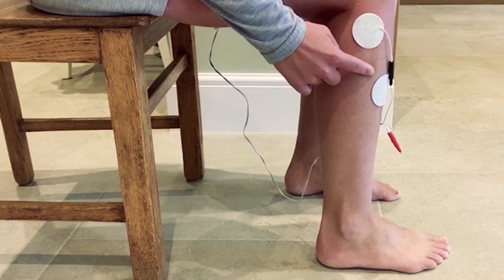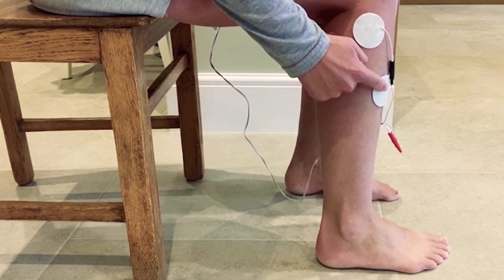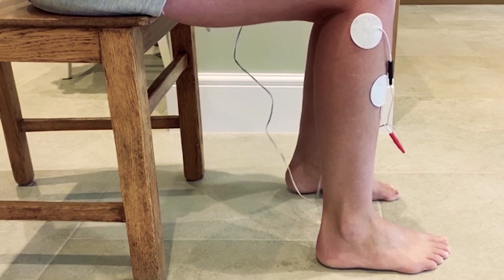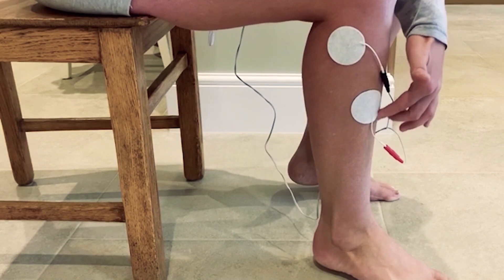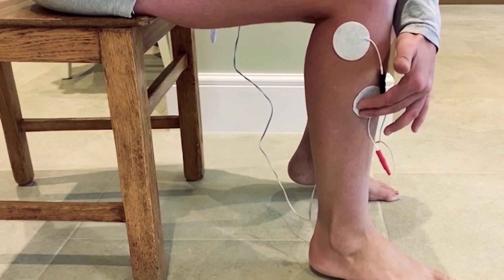The second electrode wants to be about one or two finger-breadths down, in the fleshy part of the tibialis anterior. To find that, make sure it doesn't run on the tibia bone, which runs down the front of the shin — just come in to that nice sloped channel there.